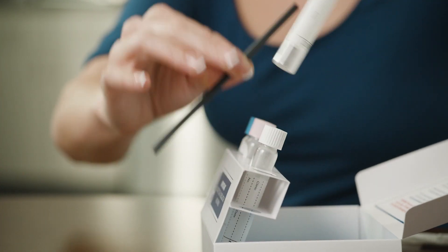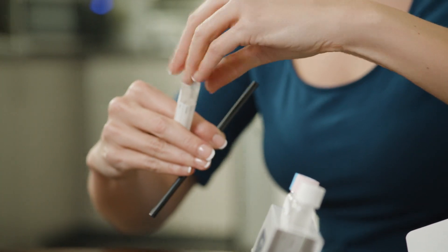Now that the final 30 minutes has passed, repeat the process with the last test tube labeled 90 min.